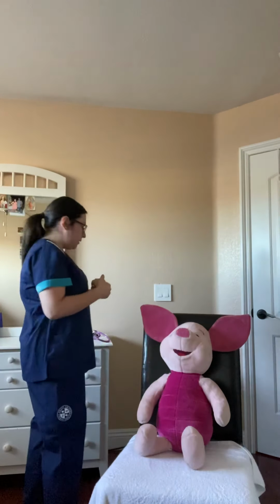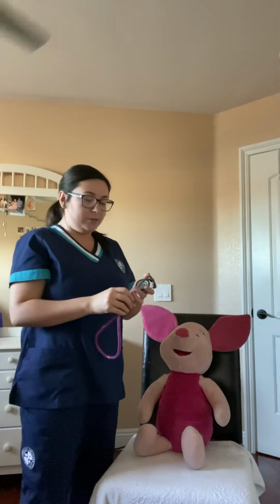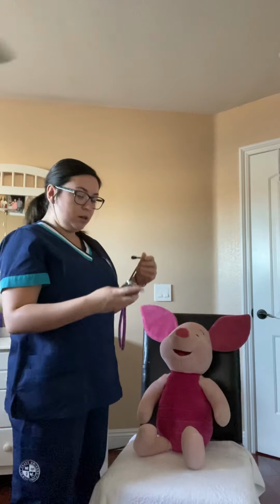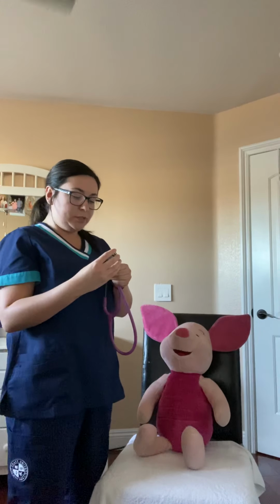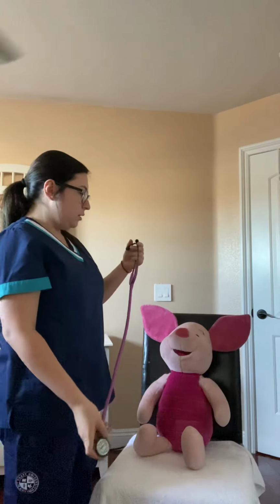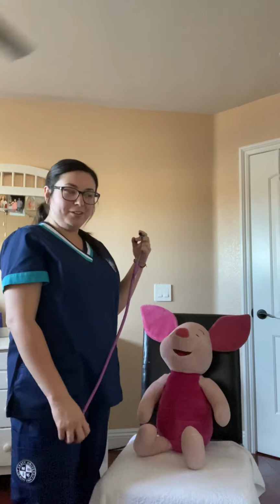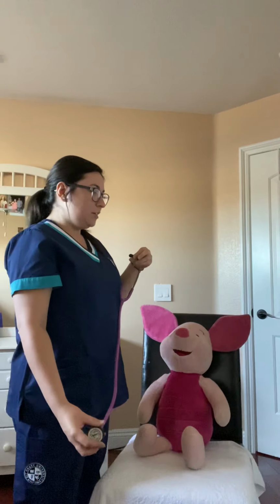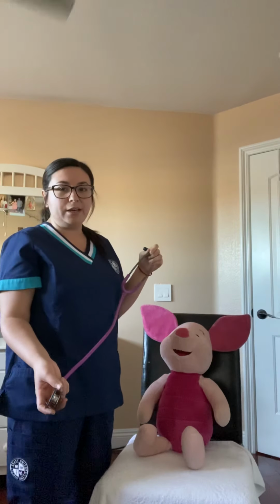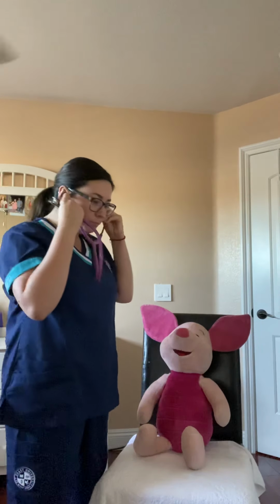So now I'm going to go ahead and get my stethoscope. I'm going to hand sanitize. I'm going to be putting alcohol on my stethoscope to make sure it's clean. I'm going to be auscultating the carotid artery, so I'm going to make sure my bell is on. The carotid artery is auscultated between the sternocleidomastoid muscle and the trachea. And I'm going to be instructing the patient to hold their breath.